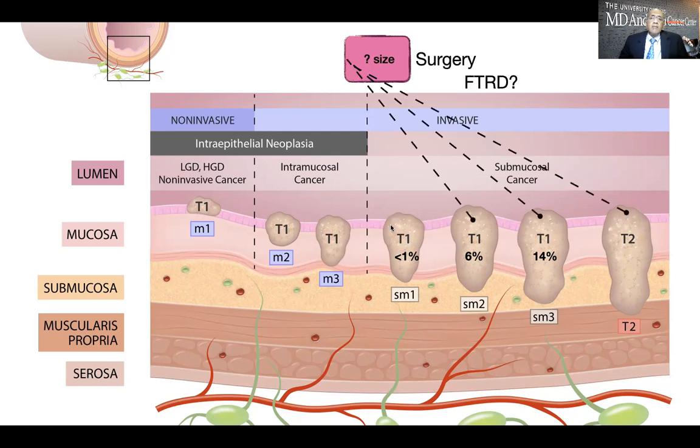However, when you have lesions that go into the deeper portion of the submucosa, they will require surgery in otherwise healthy people. In some cases who are at a high risk for surgery, one option that is coming out is endoscopic full thickness resection. Although the data on this for this problem is rather limited, and one needs to wait a little more to have a better understanding.